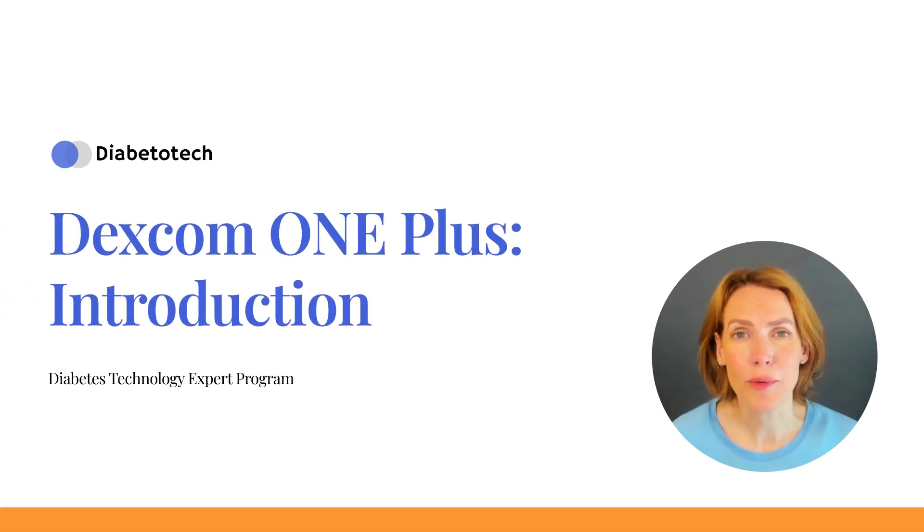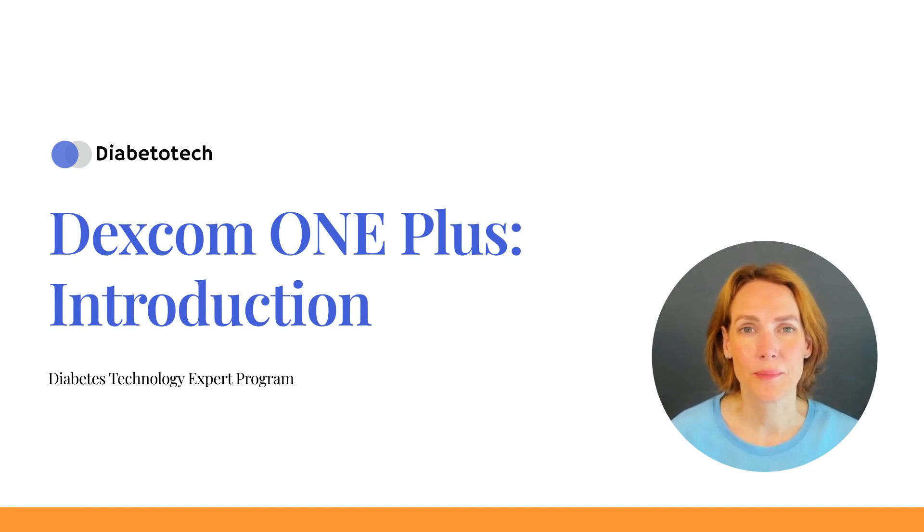Welcome to this video on the Dexcom One Plus, a continuous glucose monitor that can greatly improve your diabetes management. In this chapter, we will explore the key features of the Dexcom One Plus and how to maximize its benefits. Let's dive in!